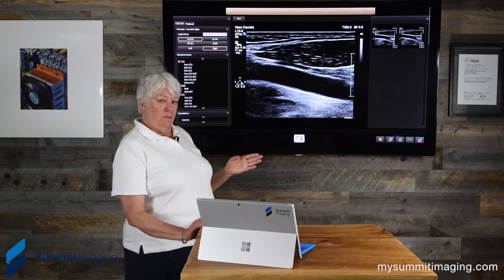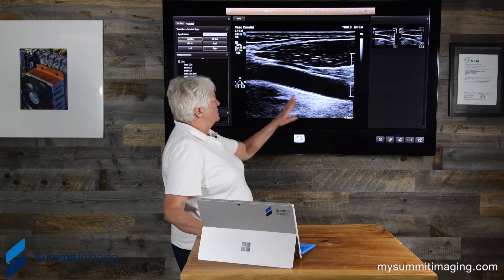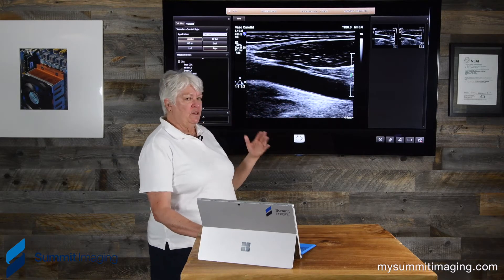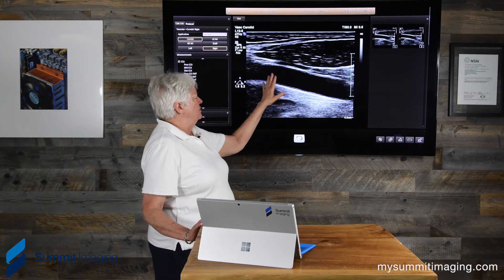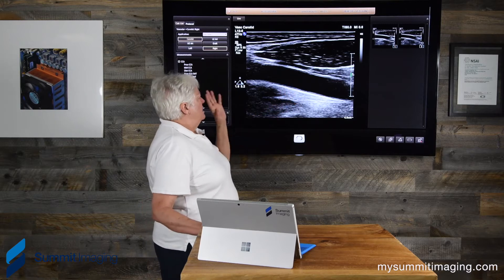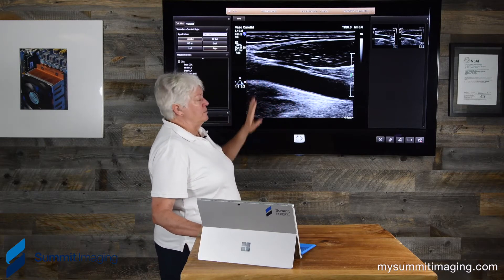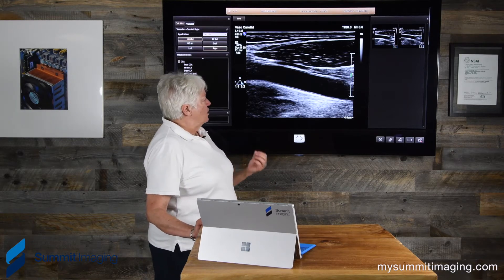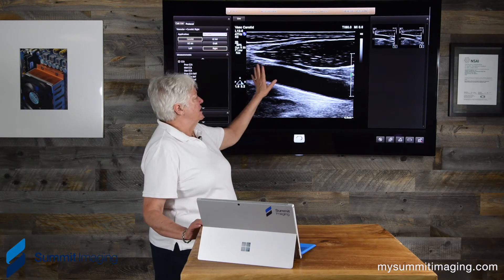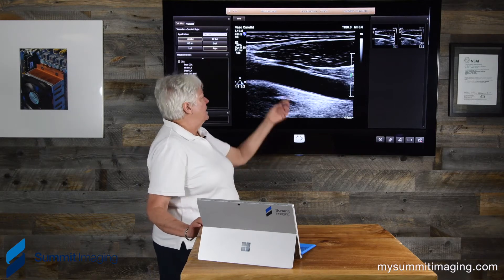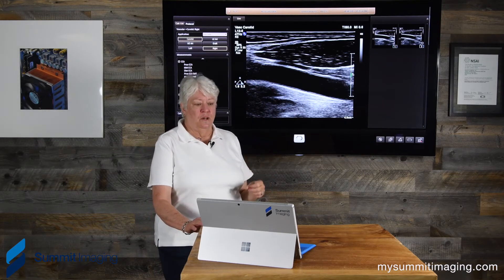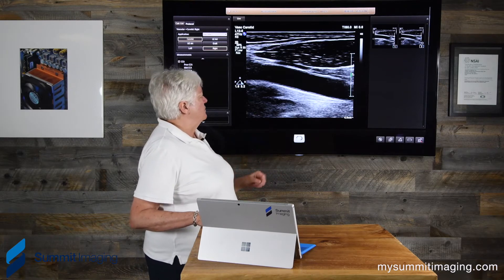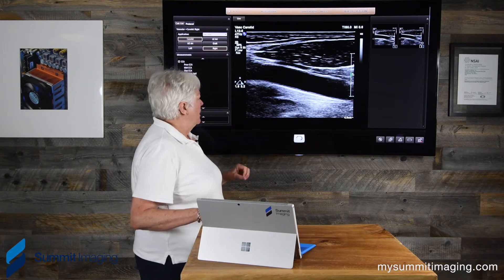The other thing about this image that would be a problem for a sonographer — and I created it to demonstrate this — is the gray here and here. We don't want a blood-filled vessel to have gray in the image anywhere. So is that a transducer issue or a sonographer issue? When the sonographer has done everything he or she can to clear this out, then it falls to the technical support team to determine if it's a transducer issue.